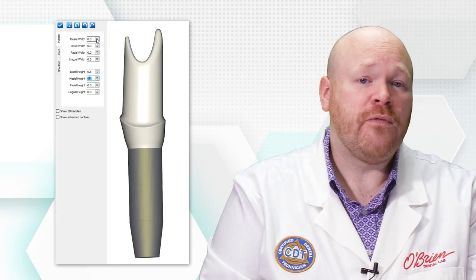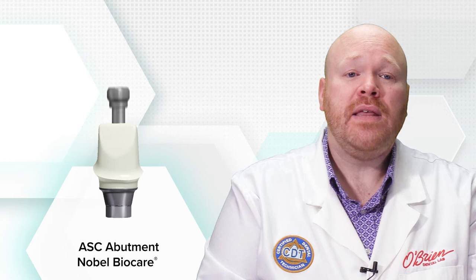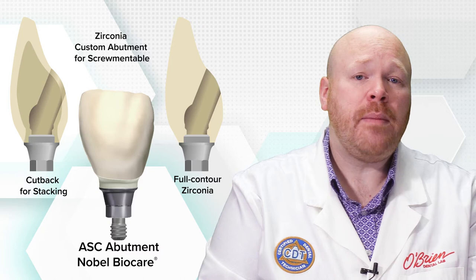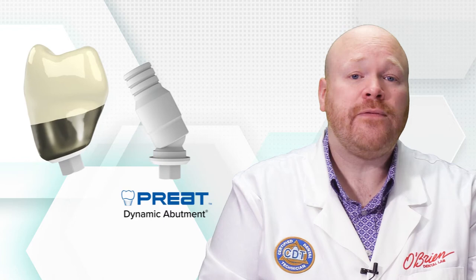The ASC abutment from Nobel BioCare is a two-piece abutment made of a zirconia top which is mechanically retained to a titanium base and doesn't require cement. The ASC abutments can be designed as full-contour zirconia crowns or with cutback for stacking porcelain directly to the abutment. They can also be designed as a zirconia custom abutment for a screwmentable crown.